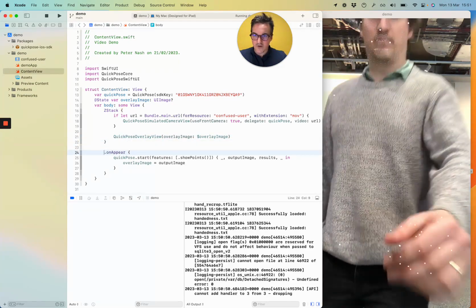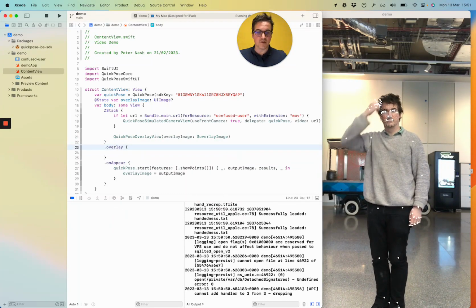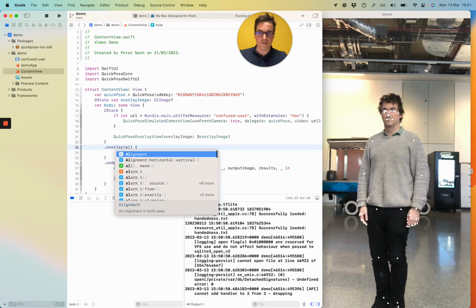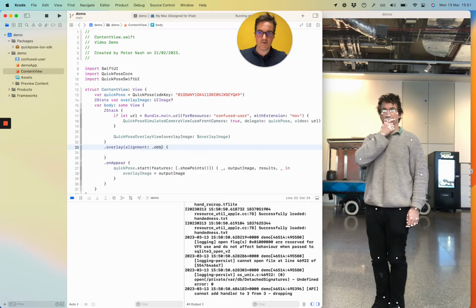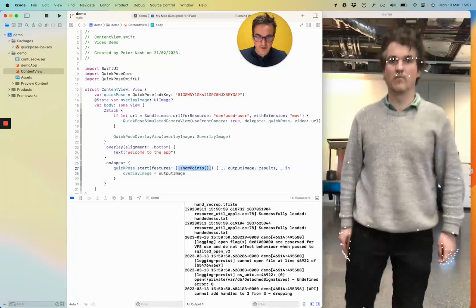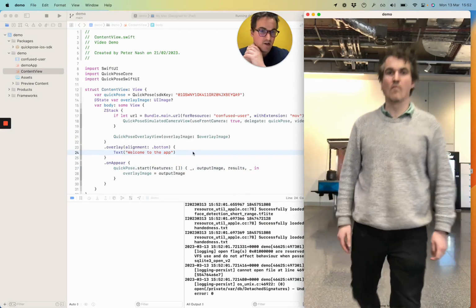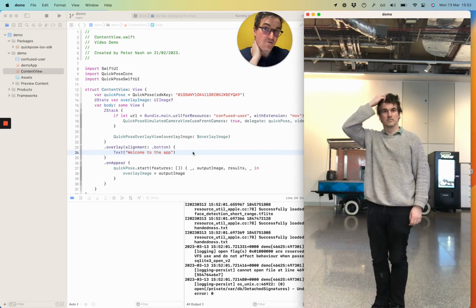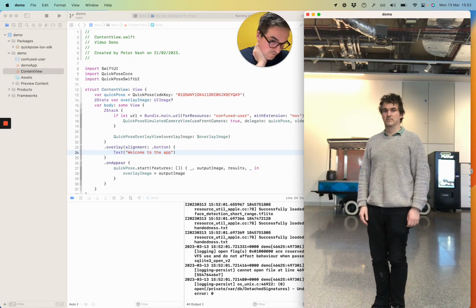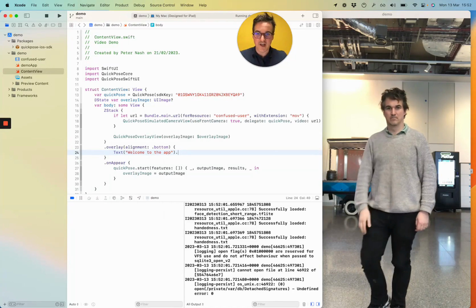Okay, so we've got on appear. What I'm going to add is an overlay, and we use this technique in our earlier videos. So I'm just going to put it along the bottom, alignment, bottom, and then we want to say something like welcome to the app. I'm just going to get rid of show points for now. I feel it's done its job of demonstrating the SDK is running. Now the eager-eyed of you will notice it's along the bottom there, but I wouldn't expect your average user to notice that. So we're going to have to make the welcome to the application a bit more obvious.